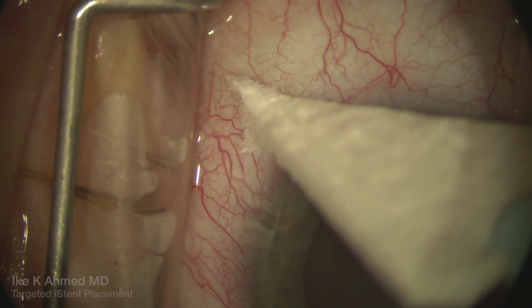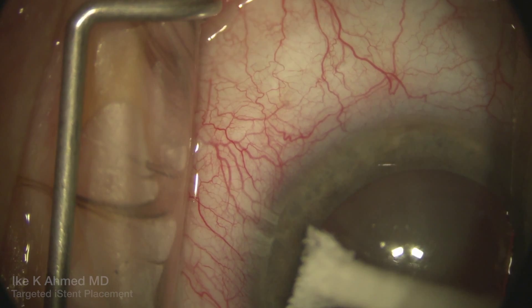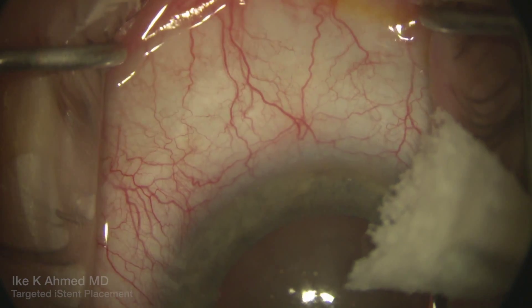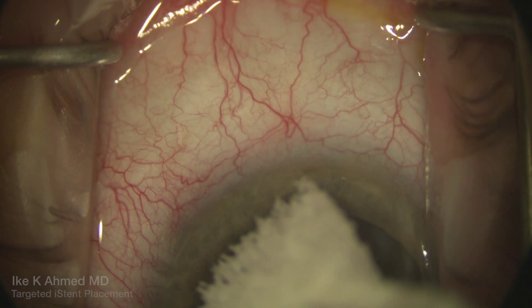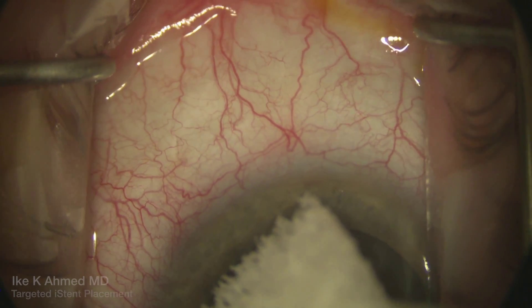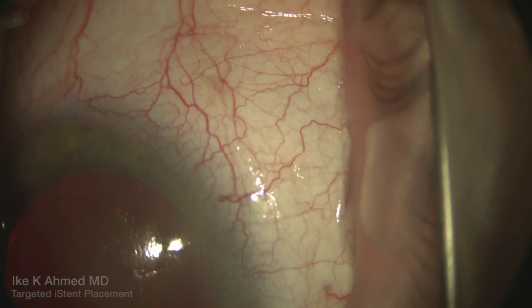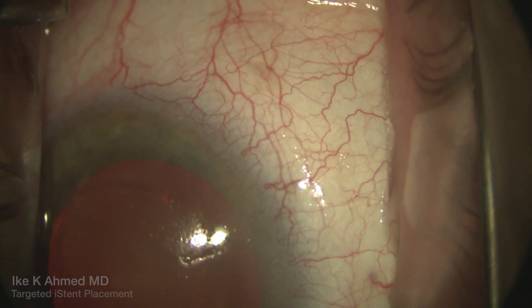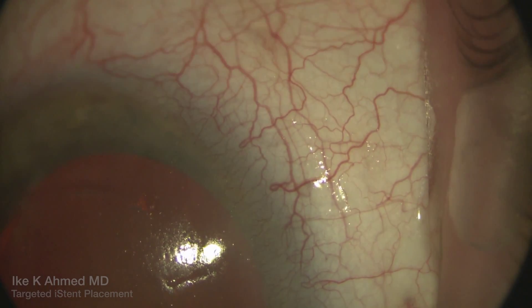Here we're looking at the left eye of a patient with pseudoexfoliation glaucoma. We're looking at the infranasal quadrant, identifying what appear to be a couple of larger caliber aqueous veins present from the inferior limbus. We glance over nasally and then supranasally, showing some of the larger caliber aqueous veins.